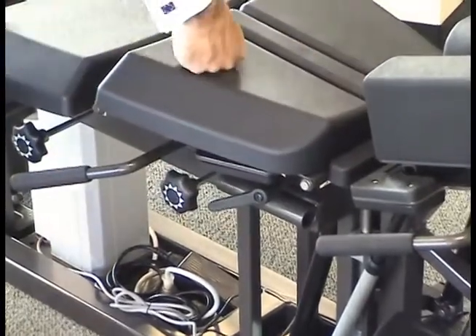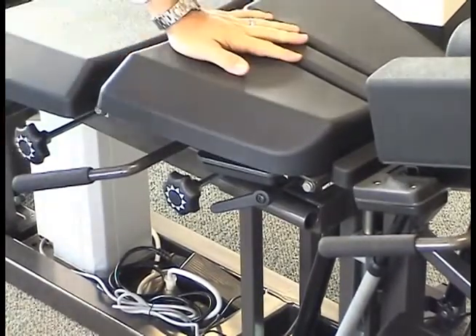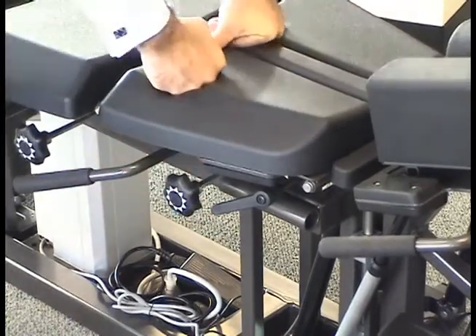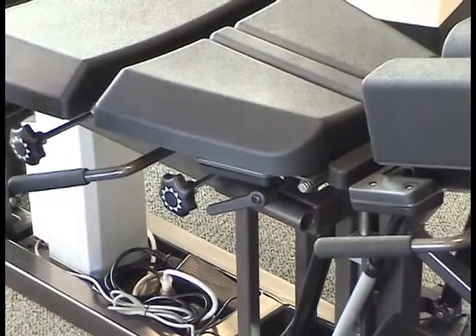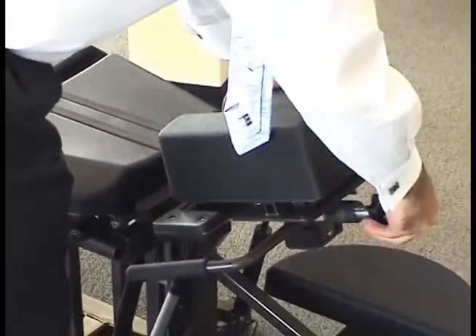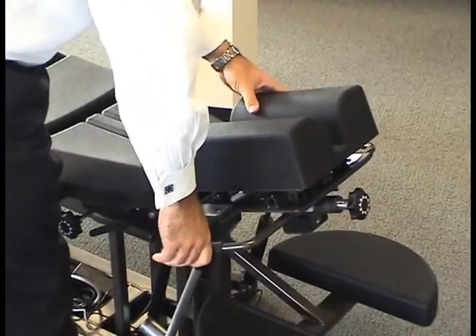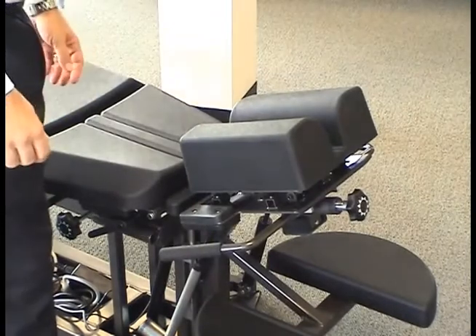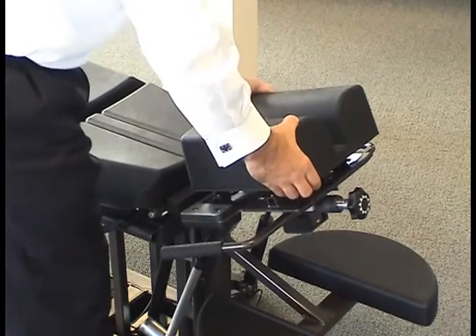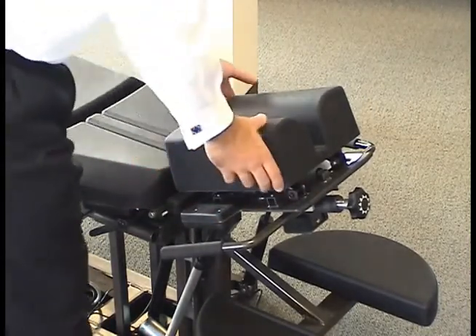A section will not drop. Reduce the tension setting on the tension knob. Headpiece will not drop. Reduce the tension setting on the tension knob. If you have the table with the headpiece that can be biased cephalad or caudad, make sure you bias the headpiece one way or the other after cocking the headpiece.